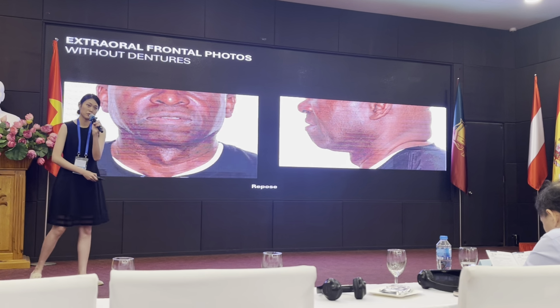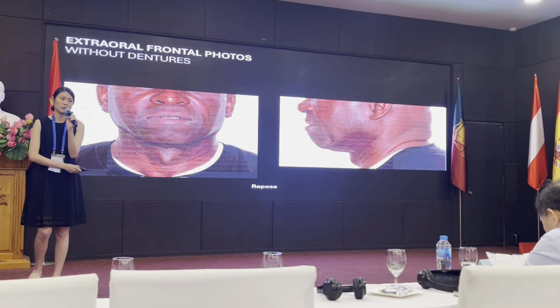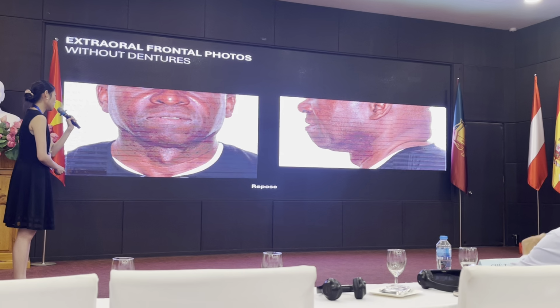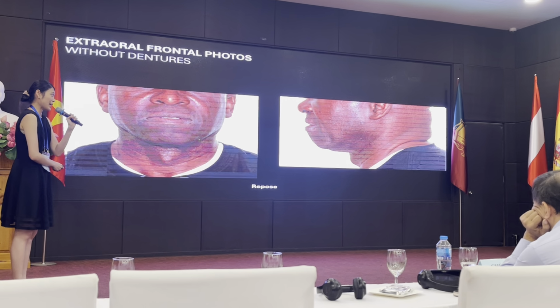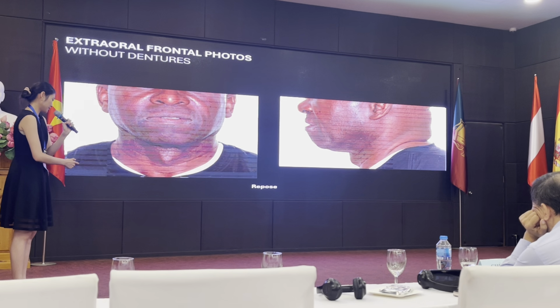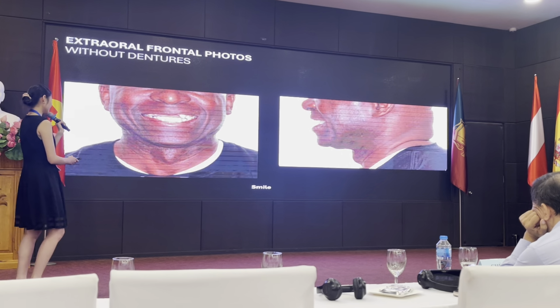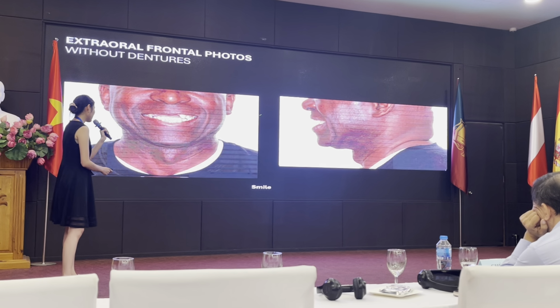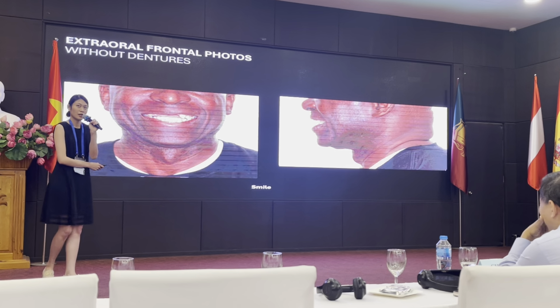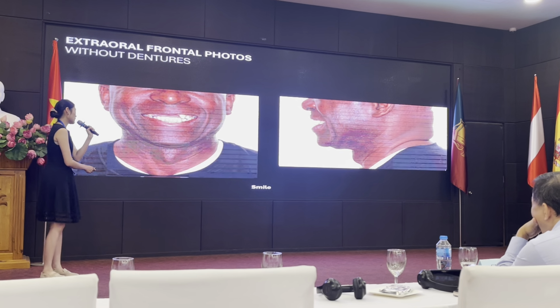And this is a repose position. So how do we get the repose position? You can ask your patients to speak, for example, like Emma, so they can open up the lips a little bit to get that rest position. And you also want to evaluate the patient's smile and to see where the future crown and implant junction is gonna be.